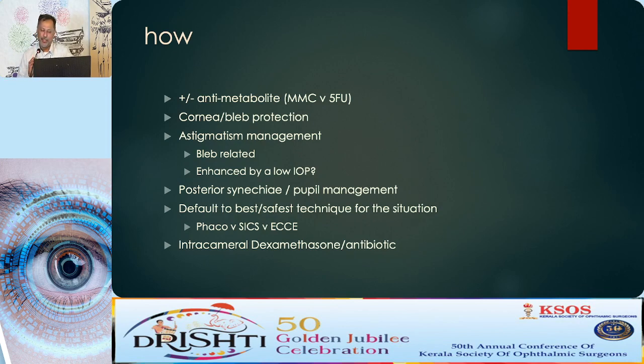Another interesting thing is astigmatism management, and it is something that I'm getting interested in these days, because you get these funny blebs and you wonder whether you should correct it. I tend not to correct the whole of it. I tend to correct a little bit of it, and patients seem to be happy. It might just be because the pressure did go up a little bit, and especially if someone has a lower IOP, any astigmatism tends to get exaggerated. So just need to be aware of that too.